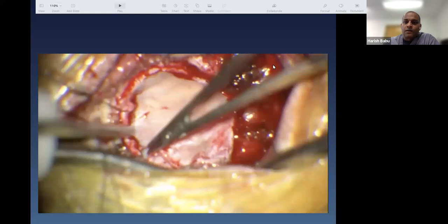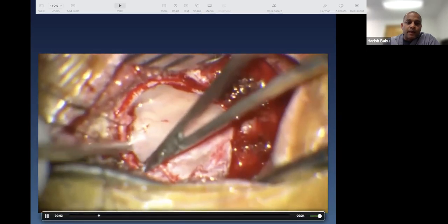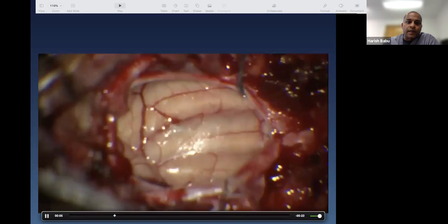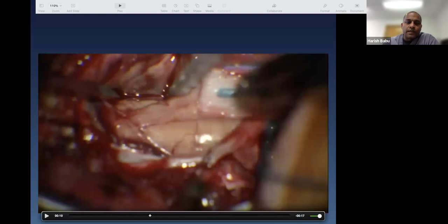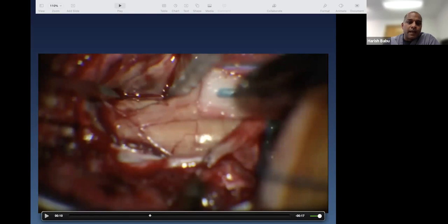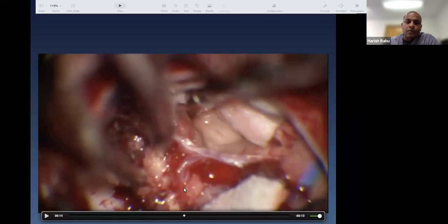To orient: cranial side, caudal side, right and left. The dura is being opened here. Once you open the dura and then the cisterna magna, you see the cerebellum. You make a corticotomy in the cerebellum, see the cyst walls lining up, dissect the cyst from the cerebellar tissue, and once the cyst is opened you start seeing the nodule with its intimate relationship with a branch of PICA.